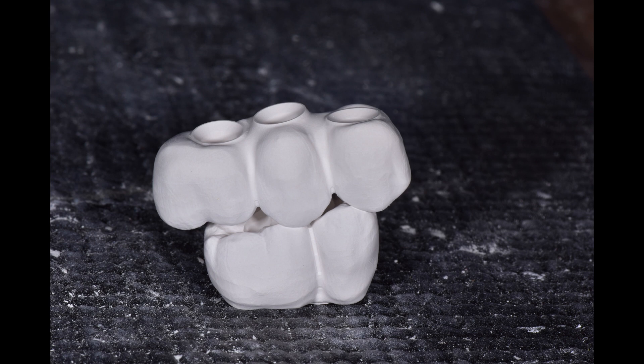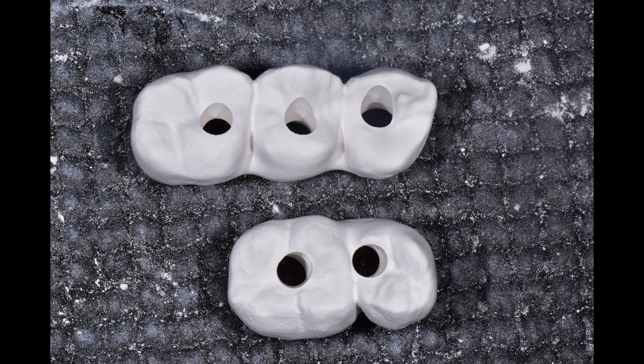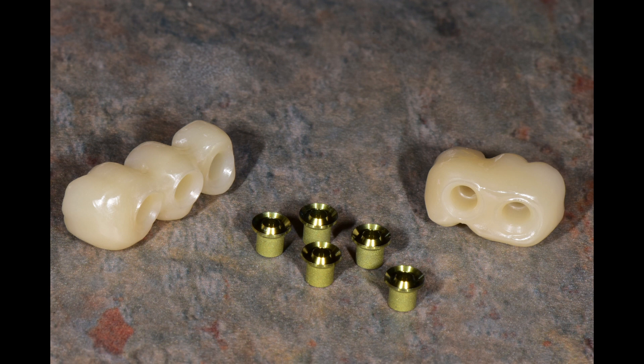I'm going to de-sprue the parts with a lab handpiece, and here are the two bridges in the green state before they get sintered. Here's another shot from the occlusal view. I'm going to sinter them for about 14 hours at 1500°C and then bond the tie bases.